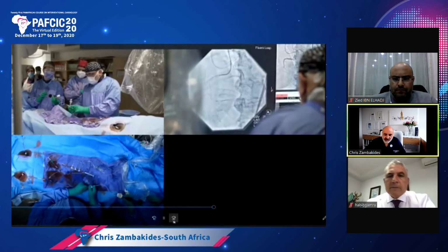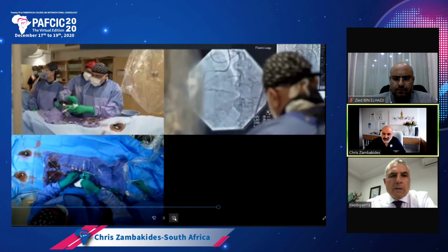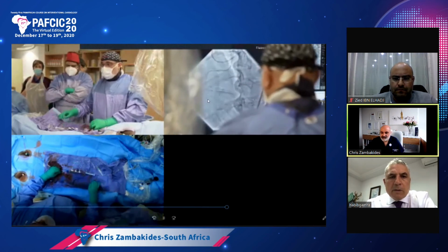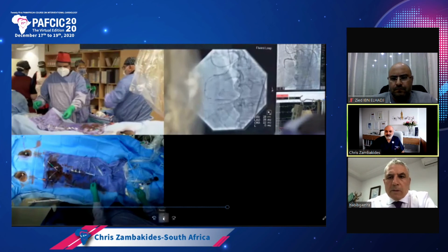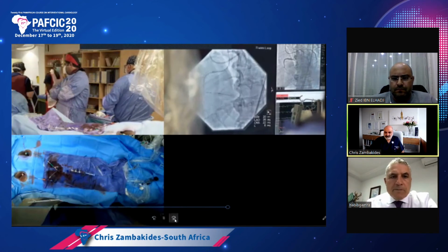If you have a trapped balloon, this is very similar to surfing the microcatheter out. So you can use a trap balloon, surf the microcatheter out, and put in a guide extension. You can see your guide extension is at the bottom. And through that, we went with the 1.5 balloon, and we managed to track the lesion. iVascular's 1.5 central marker balloon.